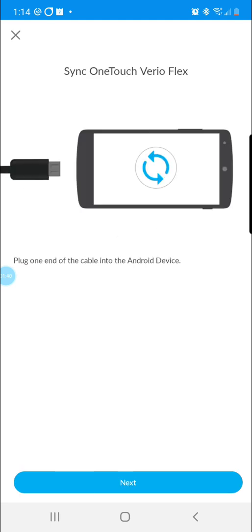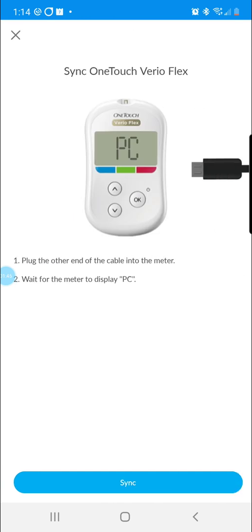Using the cable, you're going to plug one end of the cable into your Android device and then the other end of the cable you'll plug into your meter. You'll want to wait for your meter to display PC and then you will sync at the bottom of the screen.